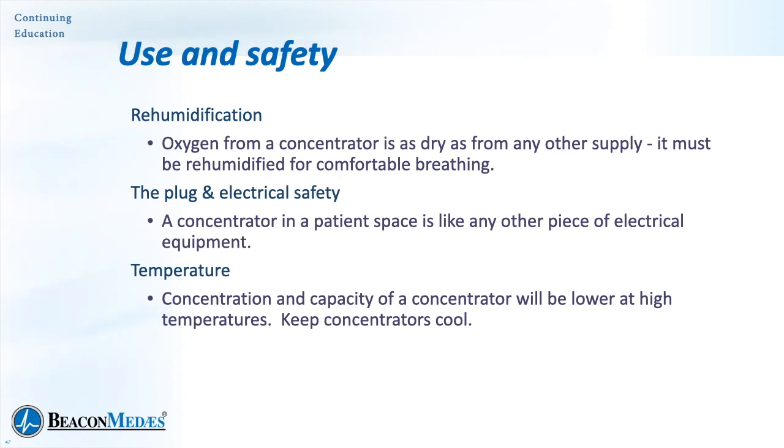Make sure that temperature is considered. Concentrators do lose capacity as temperature goes up. So the cooler you can keep your concentrator, the more effective it will be, the more oxygen it will put out at a higher concentration.